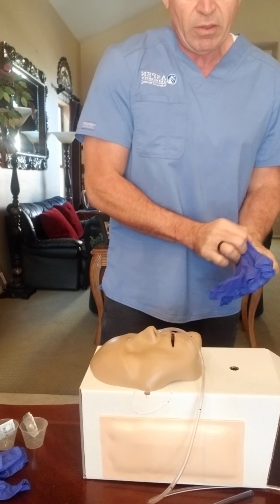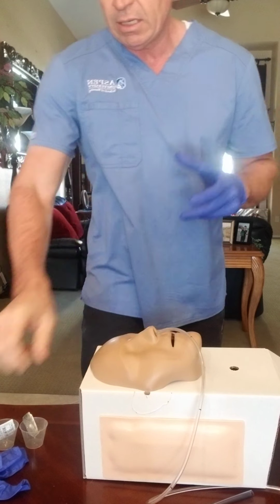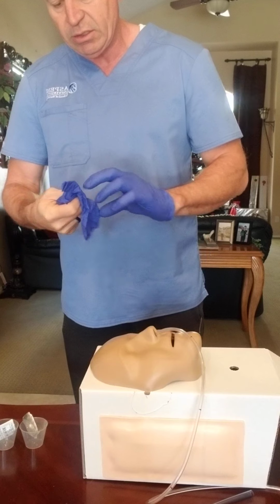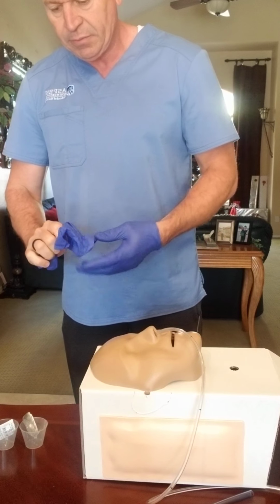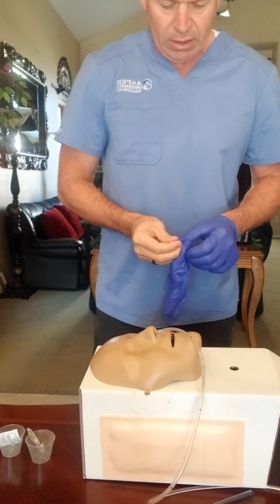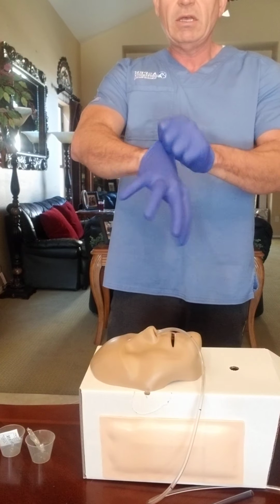I'm going to give the patient some privacy, and the reason why I'm here is because I'll be giving you your medications via NG tube, and I'm going to get those prepared. And I have your crushed medications here. And are these the medications you take? Yes, that's what I take. Okay, so first off, I'm gonna glove up.